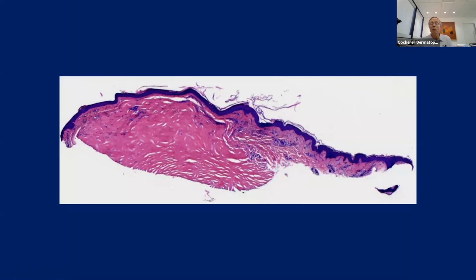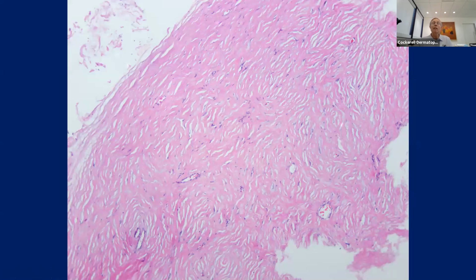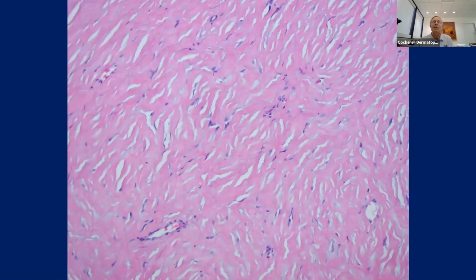We say, is it epithelial or non-epithelial? Non-epithelial, it looks like it's involving mostly the stromal collagen or maybe elastic fibers or something like that, but it certainly doesn't look like any epithelium that we would see. So benign based on the overall architecture, seems to be non-epithelial. It's got these thick sclerotic collagen bundles, and we all remember what the histologic criteria for sclerosis is: increased thickness and homogenization of collagen bundles with a decrease in the number of fibroblasts. So we have that here. And then we have these little clefts between them, which is very common in this entity.